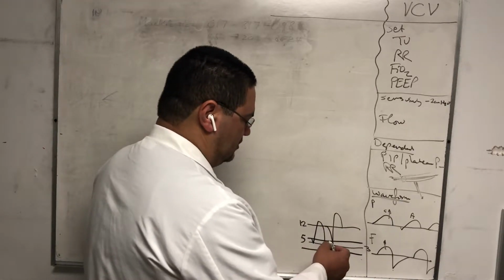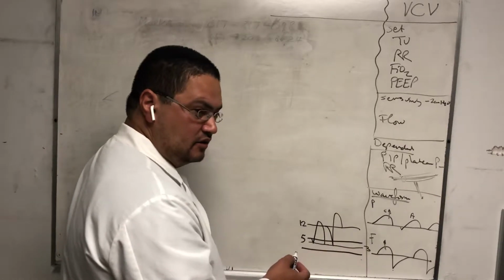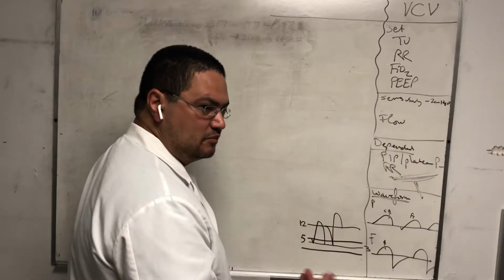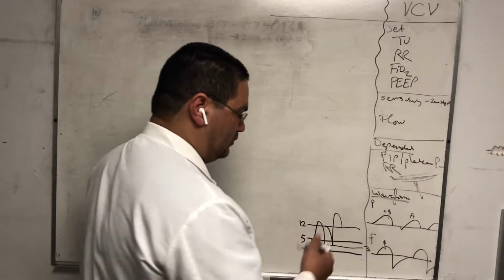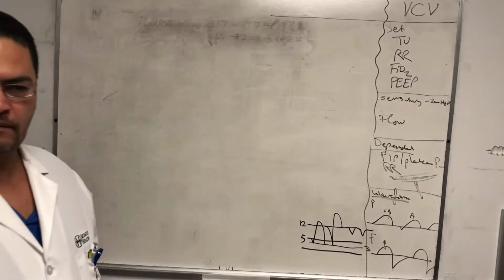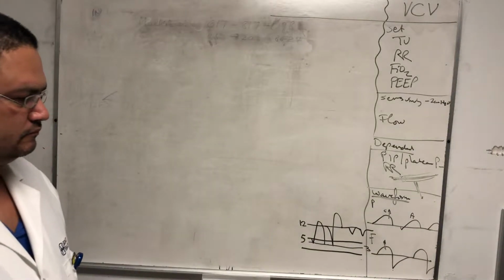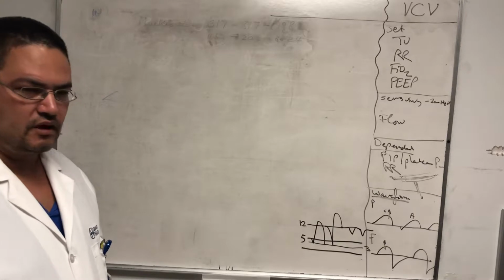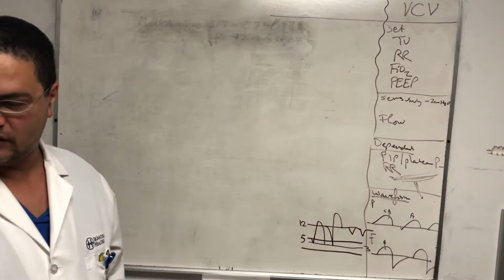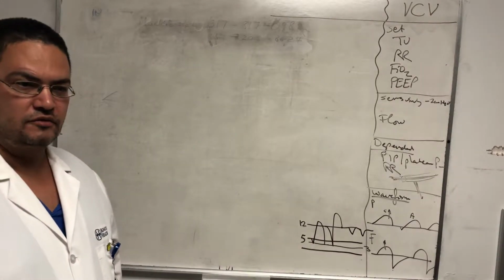But of course, this doesn't happen all the time. It happens every once in a while. The patient can take -12. People can take -12, it's not a big deal, but they can't take it all the time. That means they're breathing fast or breathing hard all the time. So you start getting non-triggered breaths. Once you start having a couple of non-triggered breaths, the patient feels very uncomfortable because it feels like he's suffocating. So that's why COPD patients failed on the vent.